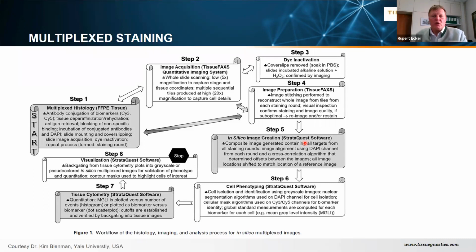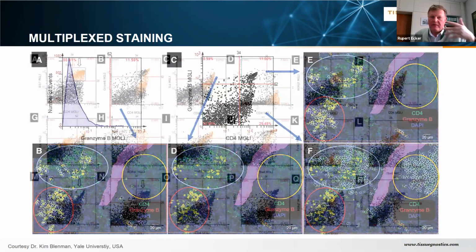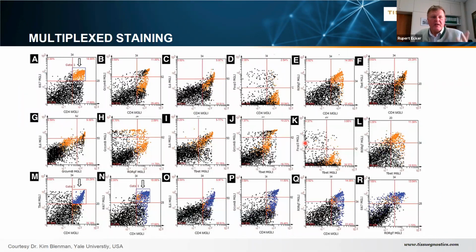several times. So you get multiple markers, maybe 10, 15, 20 markers stained on the same tissue, or rather on the same cells. So it's really a co-expression analysis. After registering, Alain Pitiu yesterday talked about image registration. After registering the sample, in this case it's pretty easy because it's really the same sample, just rescanned, and so you increase the number of channels or markers present on the same sample.